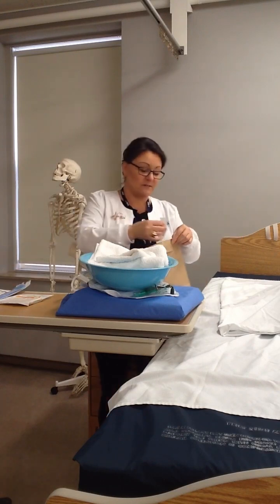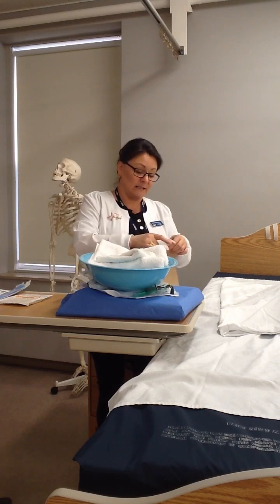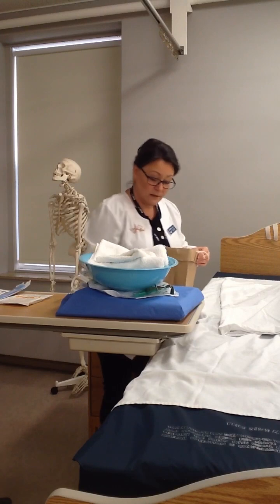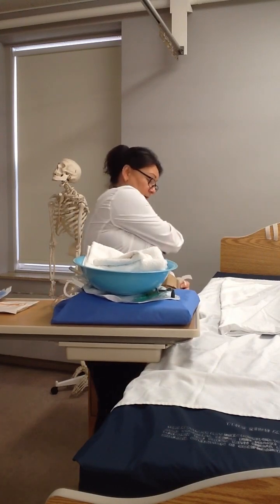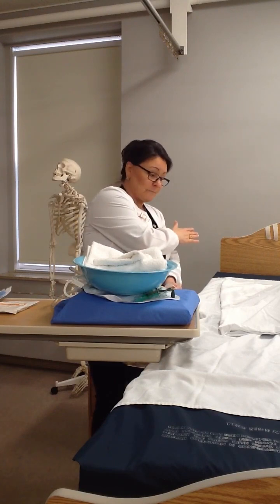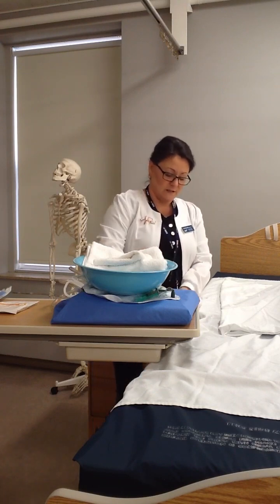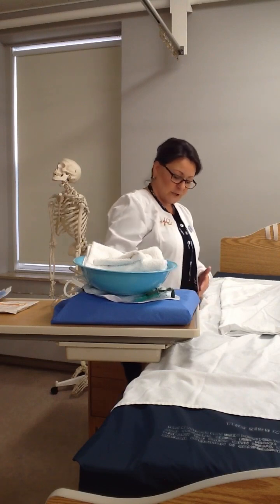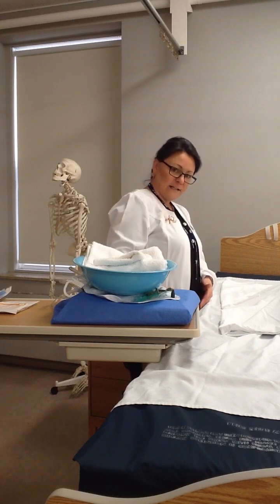So I've got a couple of pieces of tape, and again, just like I explained in the insertion of a female catheter, the placement of my bag is very important because I don't want to be reaching across my body to drop the contaminated cotton balls in or my garbage in. I want to be reaching above myself. So I'm going to put my little paper garbage bag pretty much between Jessie's hip and knee, just to my right hip.